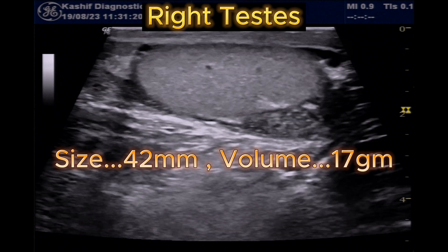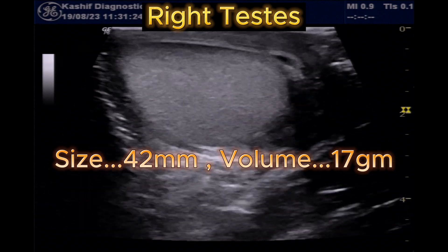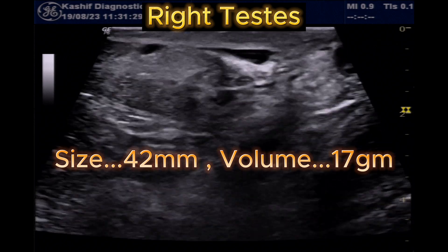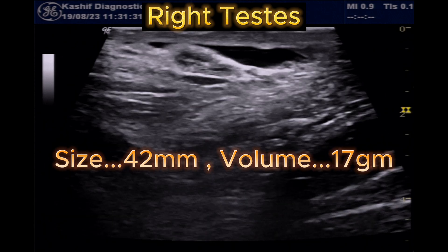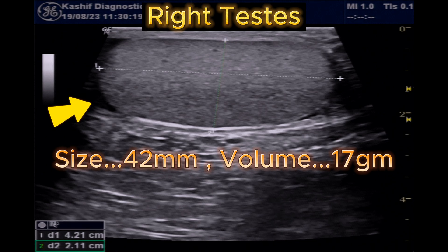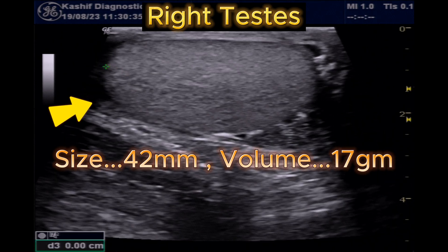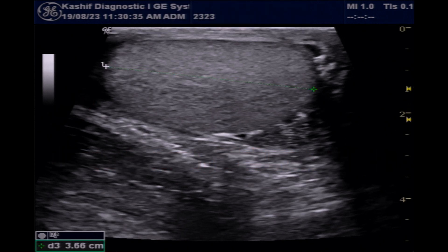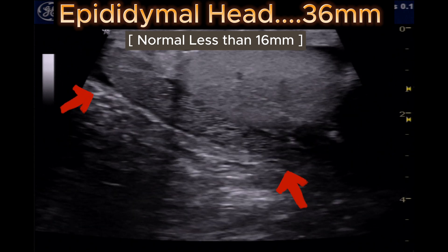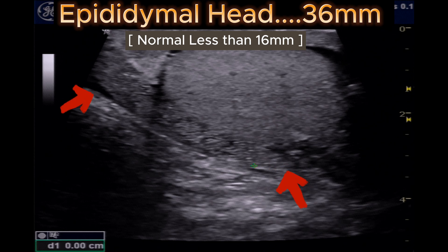In this patient there is no pre-testicular cause. Scrotal ultrasound is done to find the cause of the azoospermia. The right testis is visualized — size is 42 mm, volume is 17 grams, which is normal. Testicular echogenicity is normal and there is no mass in the testis. The right epididymal head is grossly enlarged at 36 mm; normal is less than 16 mm.